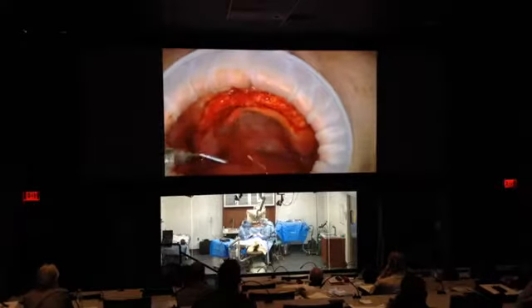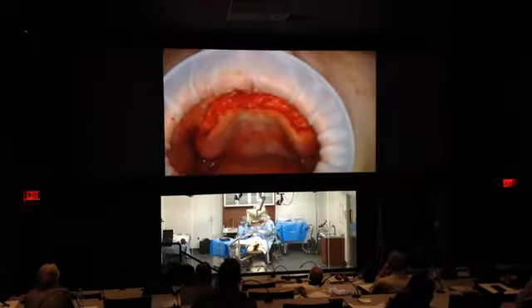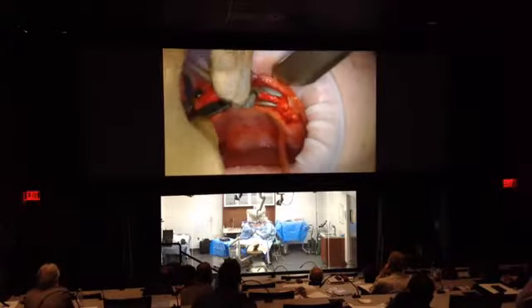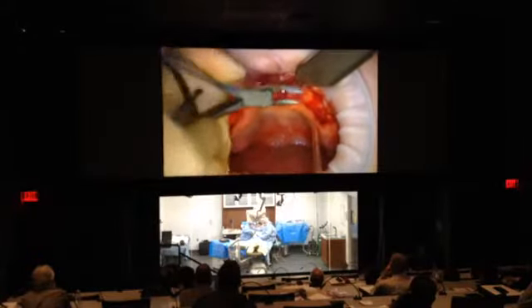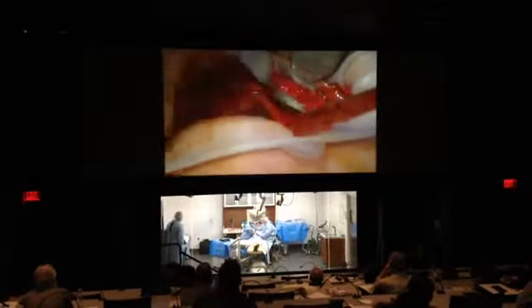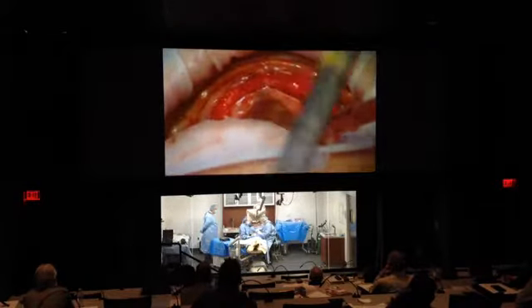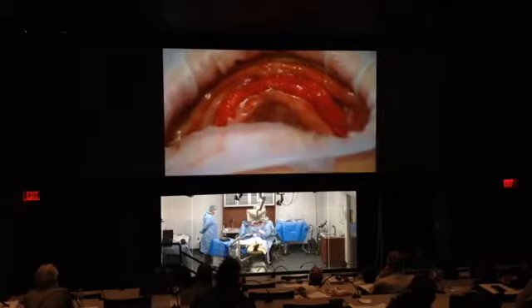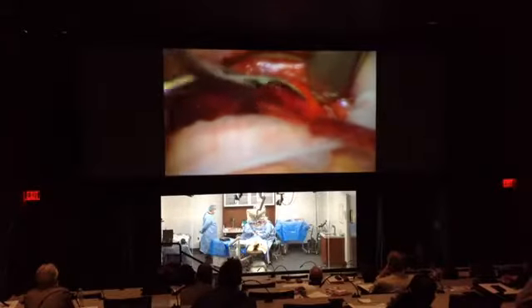Suction here on the top. Okay, let me have the rongeur. Let's reduce some of this bone. I always like to save it. See right here, this is a point that's sticking out, and typically the maxilla is pretty soft bone, so it's easily removed with a rongeur. Of course, you can do it many different ways. You can use rotary instruments to remove this, to shave it down. I just find that it's a little bit less of a mess doing it this way.